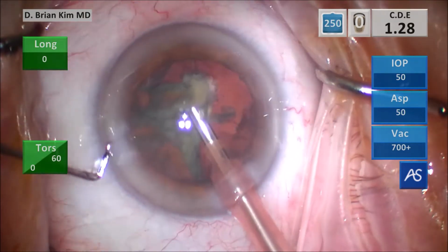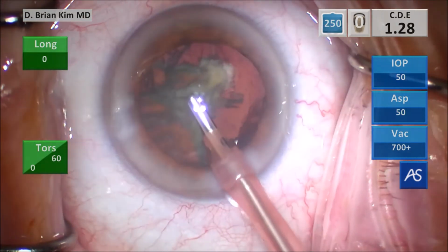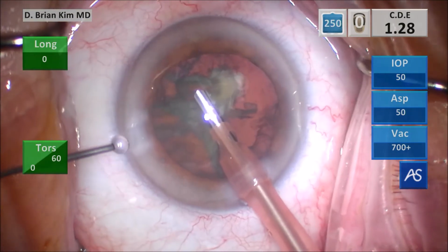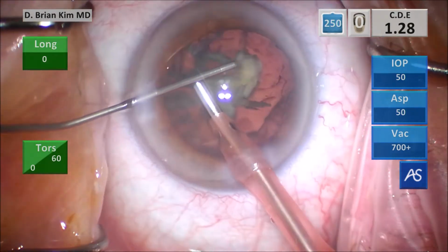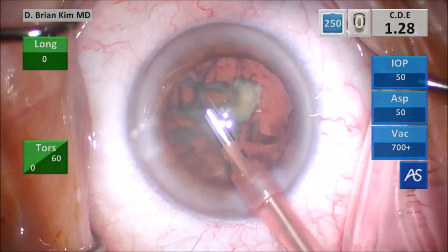It'll be no different from if you're having chopsticks and you're squeezing them together and you're tapping them together. But if you had a piece of food between the two and you bring the instruments together, you can feel that there's food there, and you have to squeeze it hard together to hold that piece of food. So that's kind of the analogy I would use.